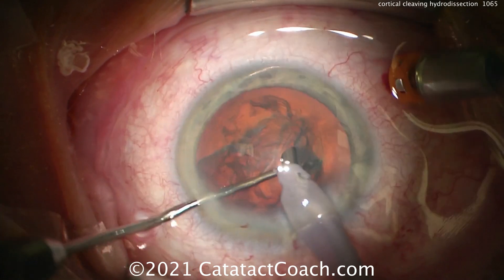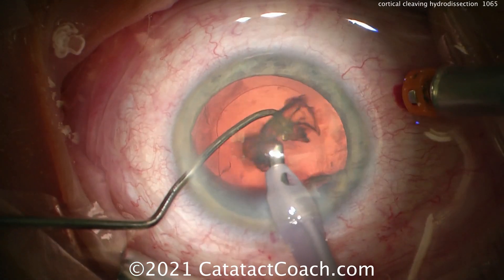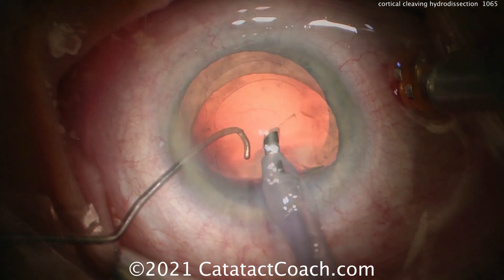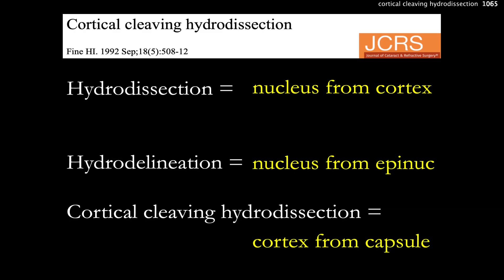Once the nucleus is fully removed, there'll be minimal to no cortex left behind — an empty, clean capsular bag. That's because the plane of dissection was between the capsule and the cortex. Standard hydrodissection separates the nucleus from the cortex, and hydrodelineation separates the nucleus from the epinucleus.